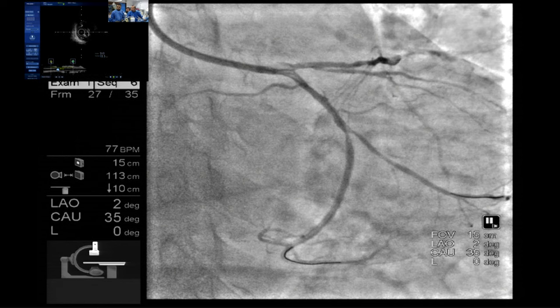No, look, just go to the proximal. Proximal. Yes, right here. What is the vessel size here? You're estimating. 3.7. So 3.5. And distal, I want a 3.5 stent. In that, I need a 3.5 balloon then, to crush the stent. This is a 3.7 vessel size right at the bifurcation, right?